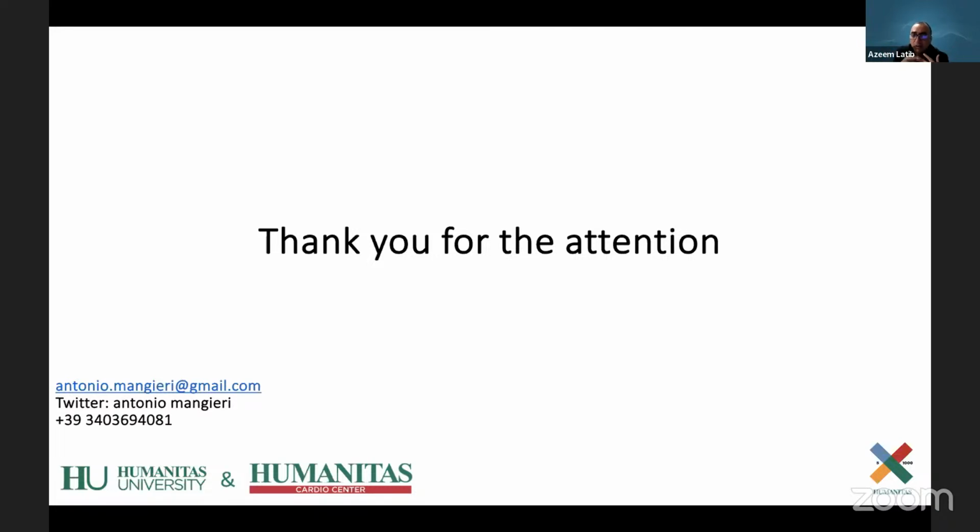IVL is becoming, I think, an important part of what we do, especially if you're in centers where you don't have a lot of rotor experience. It can sometimes get you out of trouble. I would keep an IVL balloon and reserve it for special cases, especially if there were cost constraints. But the other important thing that I want to mention, that Antonio showed you in every case, he did imaging in every single case, right? And if you're going to be successful in treating these complex lesions, you have to use intracoronary imaging. It's what makes us better. It allows us to choose the right device and the right size of the device as well.